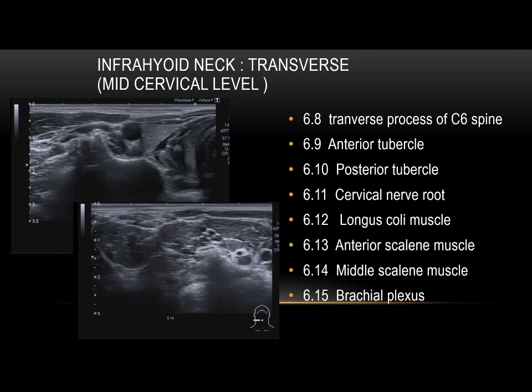So most of the time, when you are at the cervical cricoid level and you see that anterior tubercle, it is the most prominent. This is the level of the C6 vertebral body, and this is the anterior tubercle of C6, with the anatomical landmark at the cricoid level.